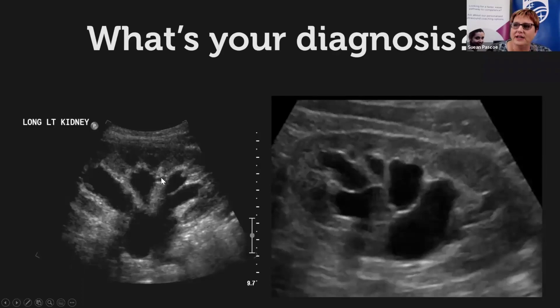And so here we've got an example of pelvic calyceal dilatation, and you can see how that is continuous through here and connects up to that ureter or the pelvis, whereas these are quite finite. You can only really tell that in real time versus on this still image that I have here. As you scan through, if it's pelvic calyceal dilatation, those pyramids join up to the pelvis, whereas in the parapelvic cysts, they are defined and you can see the edge of them.